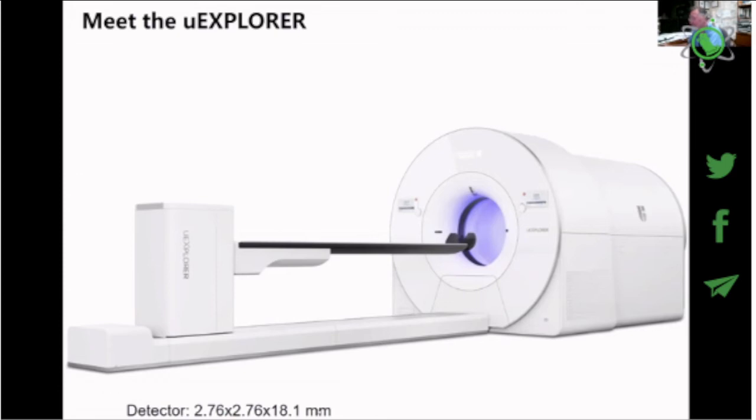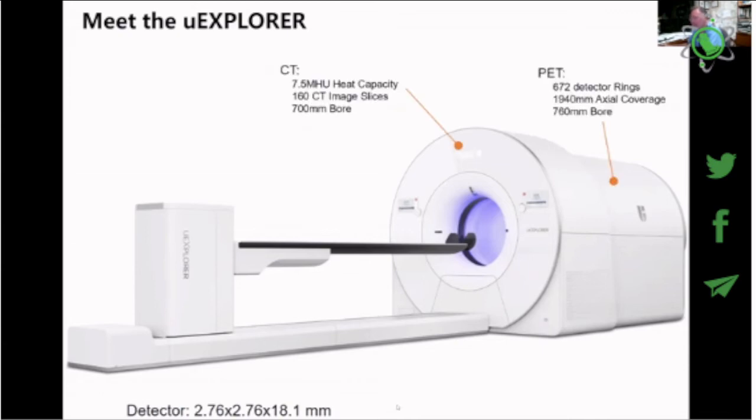This machine has a sensitivity of 171 counts per second per kilobecquerel. It has also a very good resolution of detector elements that are of 2.7 by 2.7 millimeter. It has a timing resolution of about 430 picoseconds.